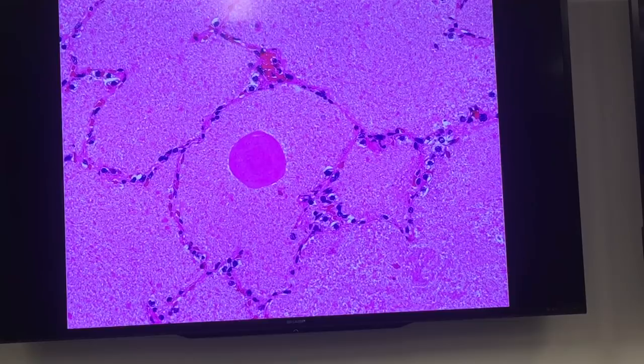This is alveolar proteinosis. Why it's not pneumocystis is, although pneumocystis also fills the air spaces in a similar way with granular material, you get these chunky pieces of surfactant material that glob into globules. And the important thing that distinguishes PAP and PCP is in PCP you see little dots within the frothy material, even on the H&E. You can actually see those dots are the organism. And one more clue, which I was hinting at before, is in PAP the alveolar septa are normal. In PCP they tend to be a little bit abnormal. There is inflammation and so forth. So there is overlap, no question about it. And it's not a bad idea to do a GMS when you're thinking of it.